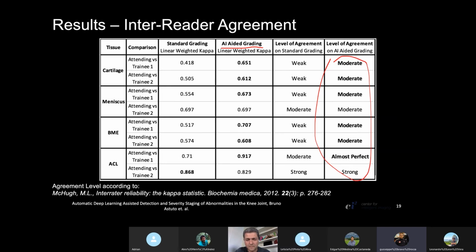I don't know if you have tried this case, for instance, how good is the model in generalization when you try out input images from different hospitals, different images from different machines, because you have tried with MRI images from a specific machine type, but how about images from another country?